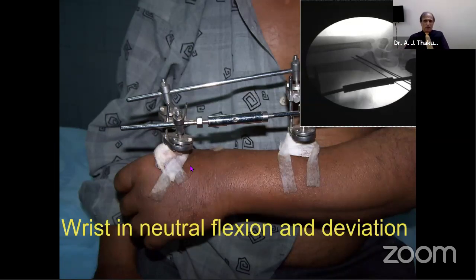My choice today for lower end of radial fracture is plate. If a patient refuses to submit for plating for whatever reason, economic or fear or whatever, then the next best I offer is an external fixator, and they do extremely well in this. Deformities are well corrected. One can use some pins or even screws and control the smaller fragment and span them out till they solidify in 6 weeks time. Only thing, they need a little more physiotherapy, a little more time to come back to normalcy. In plating, by end of 3 weeks, they are almost forgetting which side was fractured, while here they keep on cursing the doctor for the next 6 to 9 months because they have some trouble or other. But it works. There is no issue about that.